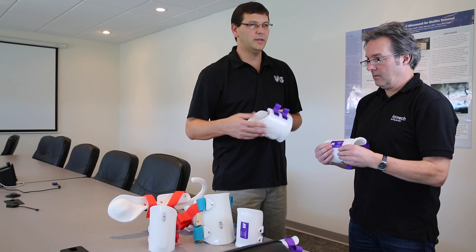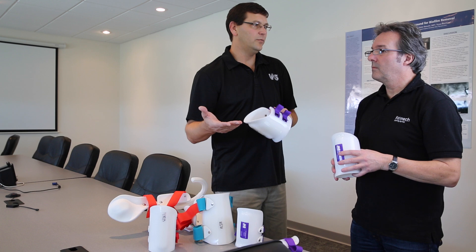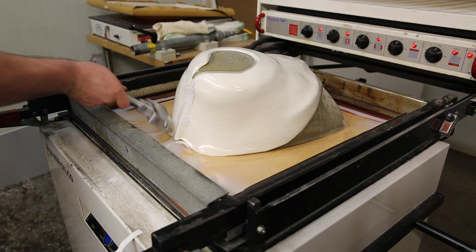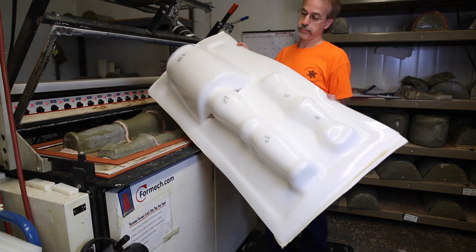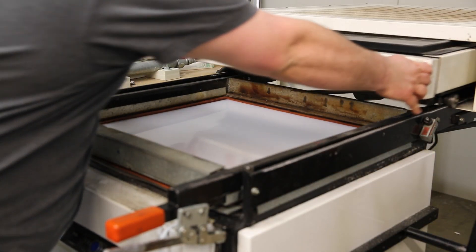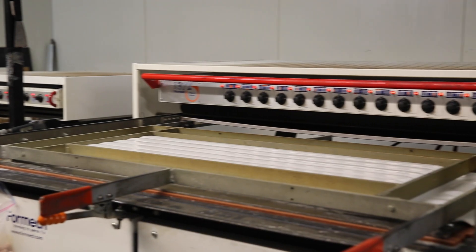The reason we do it that way is we used to buy our cuffs and they were expensive. So we started off with a two-foot by two-foot Formec vacuum former and used it for prototyping, and we developed how to make our own cuffs to make them more affordably priced. Vacuum forming is probably the most important part because with these cuffs they've got to be sized to fit the patient, and good vacuum forming allows us to size those cuffs better.